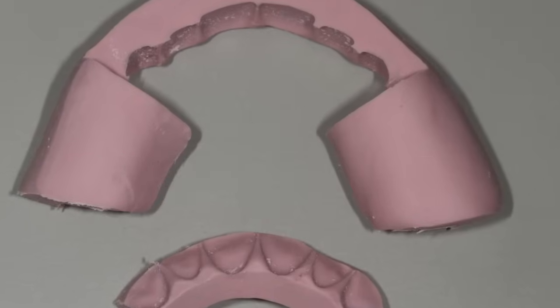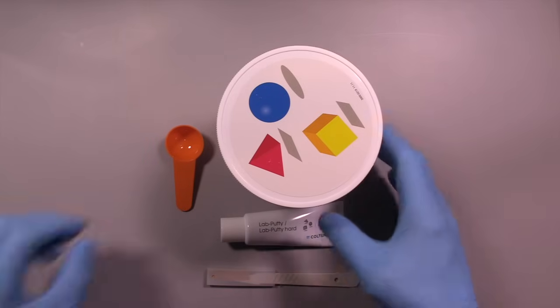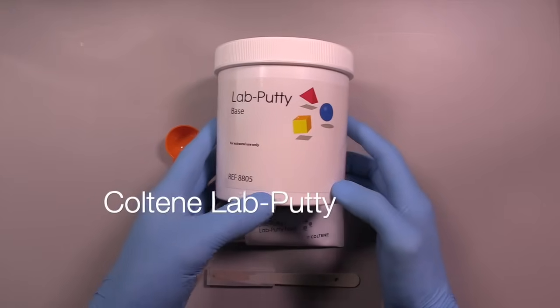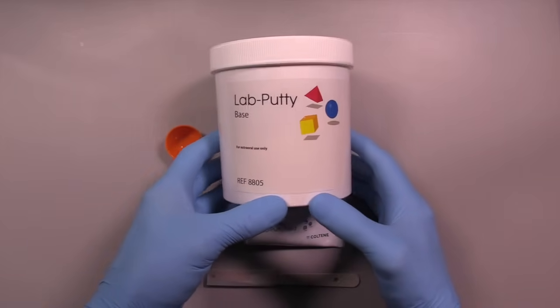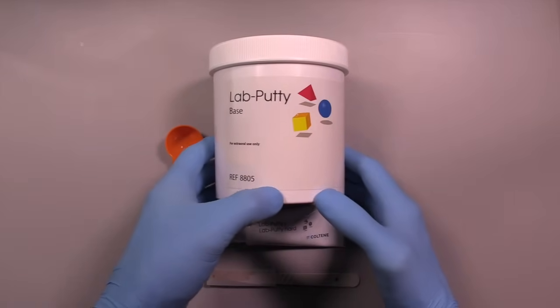Part one: preparation guides. For the preparation guide we're going to be utilizing a product called Lab Putty, made by Coltene. This particular product is a condensation silicone and it comes with a base and a catalyst that comes in a separate tube. The product is relatively inexpensive and can be obtained in smaller quantities or very large quantities — you can buy huge tubs that are about two gallons in size.